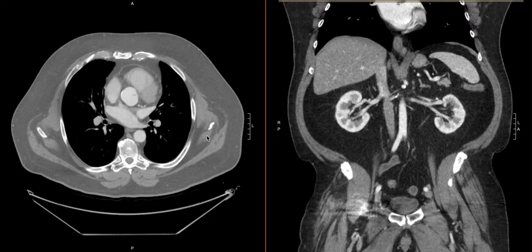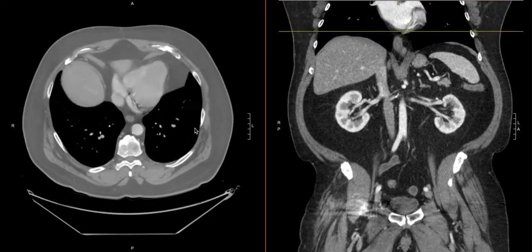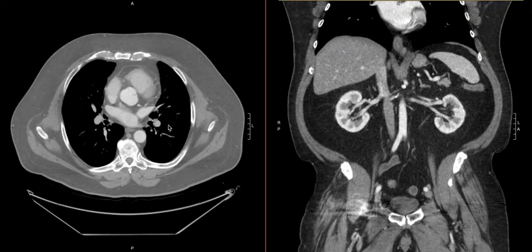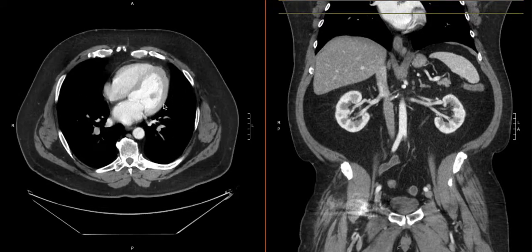We'll go to the left side as well and just look at the pulmonary artery system that we see, looking for any filling defects. Doesn't look like there are any there. So we can check off this part of our scan. But it's important to realize that we only look at very little of the pulmonary arteries because that's all we have. Now what we can do is go back to our abdominal window and just orient ourselves.